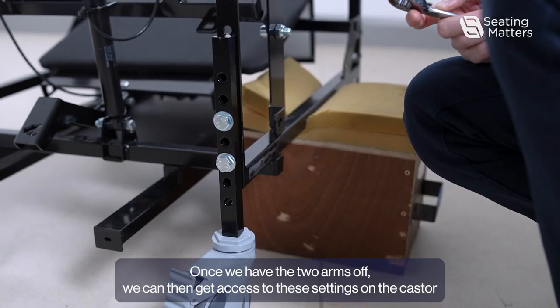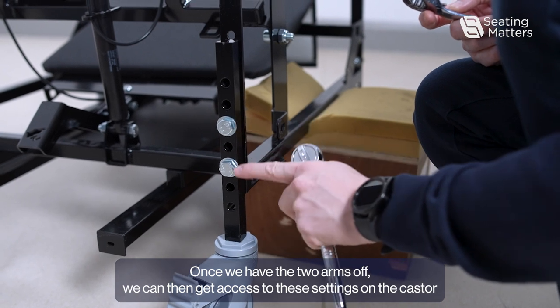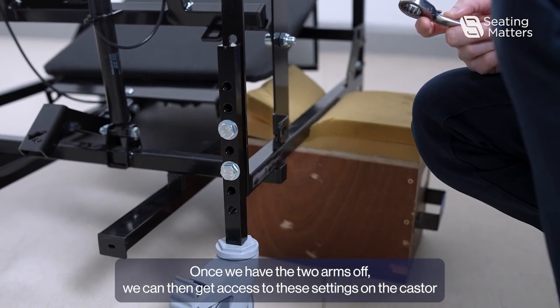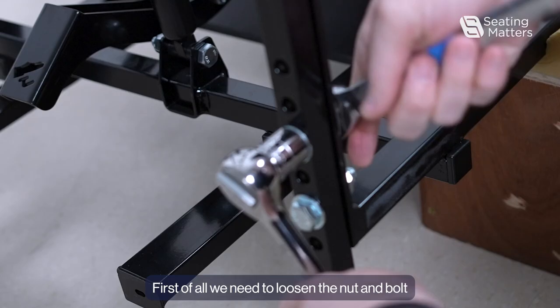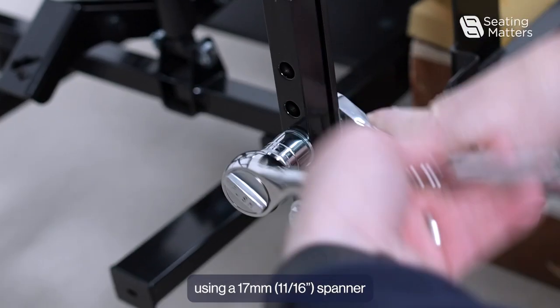Once we have the two arms off, we can then get access to the settings on the caster which allow us to change the height. First of all, we need to loosen the nut and bolt using a 17mm spanner.